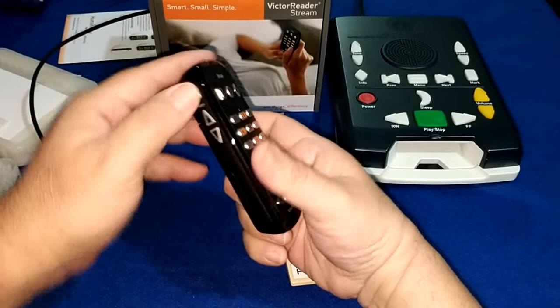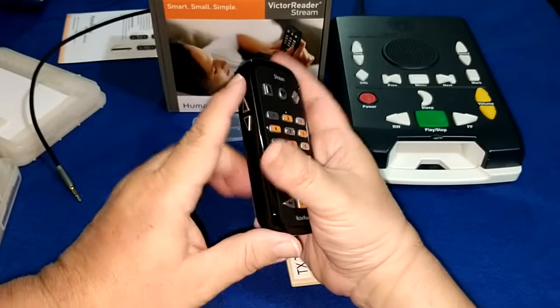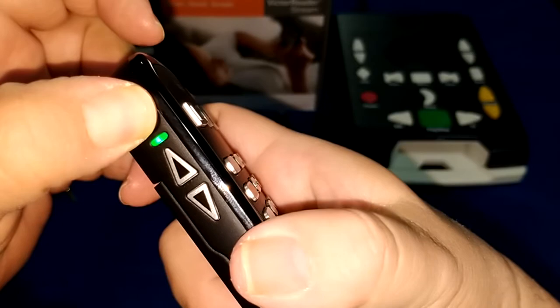So now let's turn the player on. If you have a Victor Reader, you know how to turn it on. If you don't, you'll use the power button on top — the circular button on the left-hand side above the two volume buttons and the arrow keys. You'll hold it down just like this until you hear a beep and the light comes on. There's your beep — now you're going to get your welcome and you're going to hear a chime.